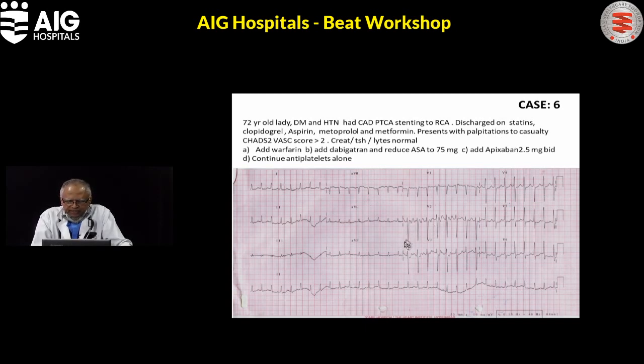What is happening is, you can see suddenly the QRS, QT, everything becomes squished up and then it becomes wider. The tape speed changes, and that's where it looks like there is an artifact. That's why it looks like a varying RR interval. This is not atrial fibrillation. This patient was given a dose of IV adenosine, and successfully, it was ablated later on. All that she had was an AV nodal re-entry.